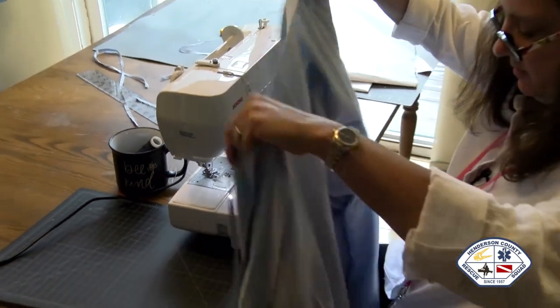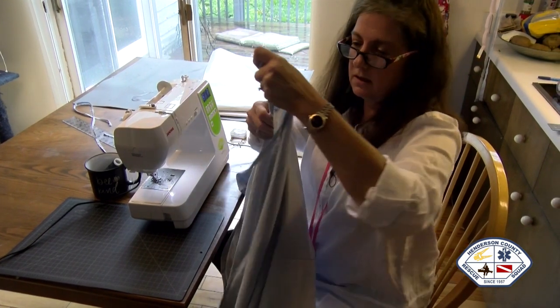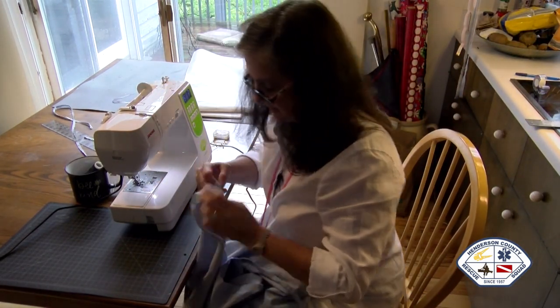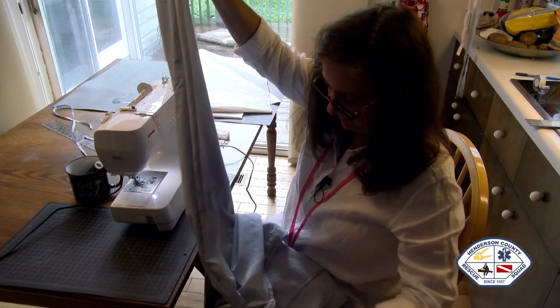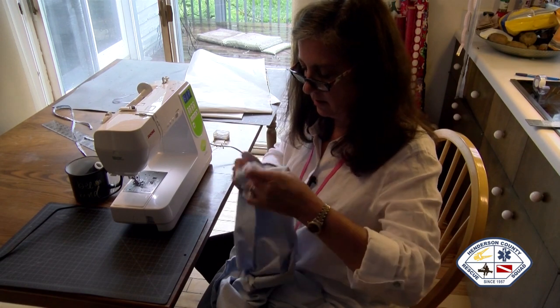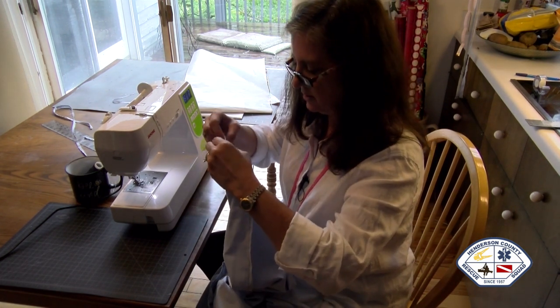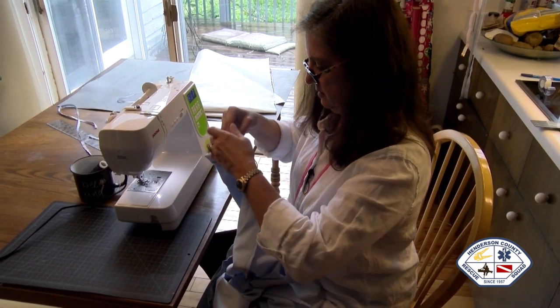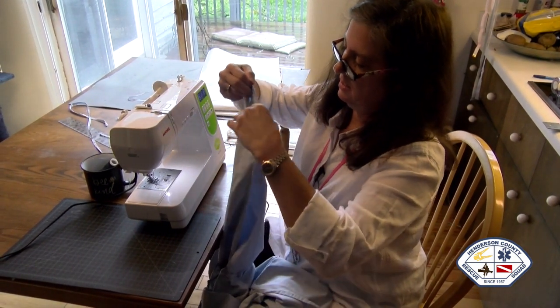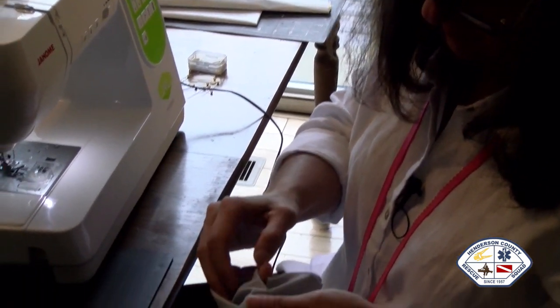Now, okay, what we have now is a sleeve, a neck, a back, another sleeve, a neck, and a back. Now, let's flip this sleeve. Oh, let me turn the wrong side out again so we keep the black thread on the outside. Okay, we allowed 2 inches in front of the thumb hole there. So let's turn it under and go flip. If you want to measure, I'm measuring about 3/4 of an inch, maybe an inch, but I want the hole to have a little bit of room at the bottom of the sleeve before you get to the hole.